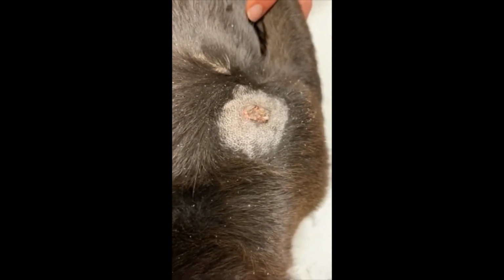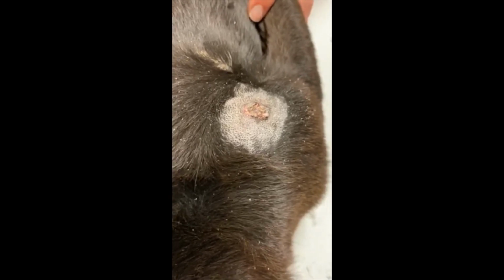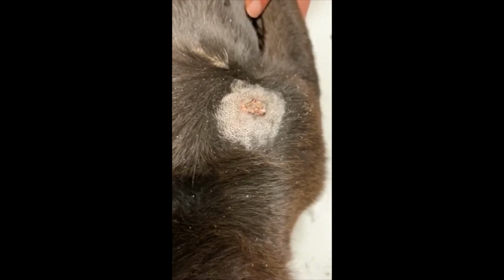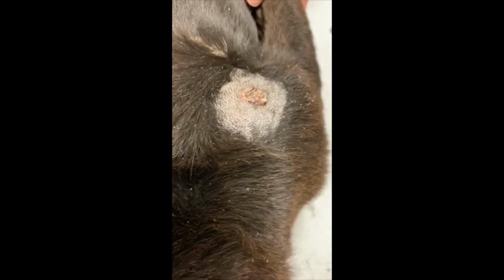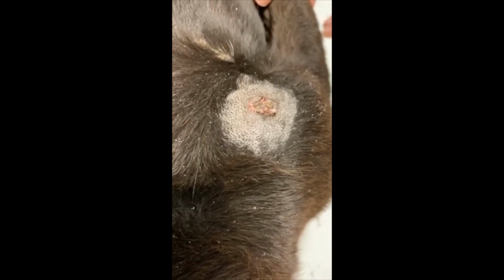In some cases with fractious animals or masses around the face or the genitalia, I will put a bleb of lidocaine under them so as to reduce the sensation at the site of freezing.